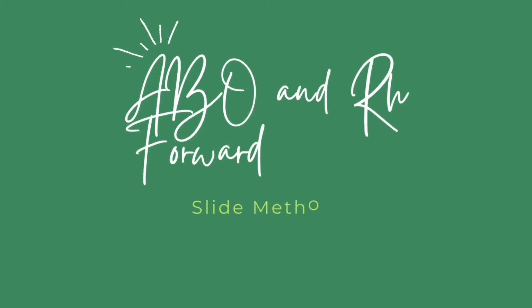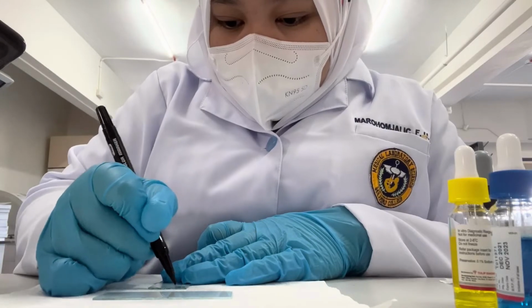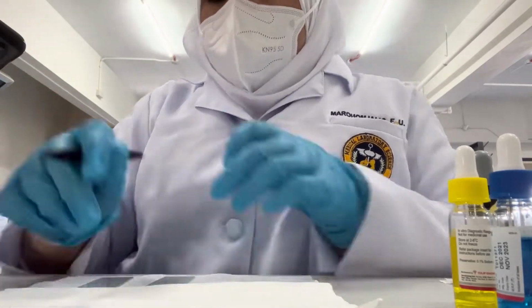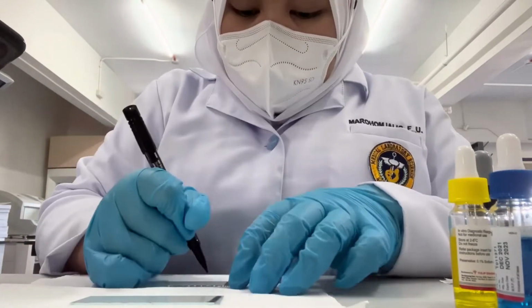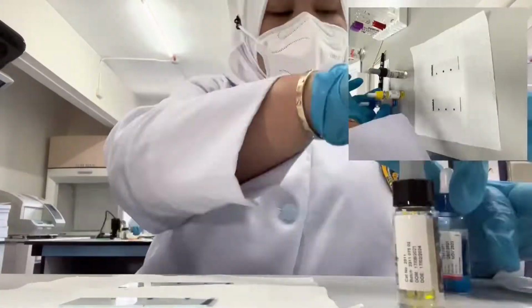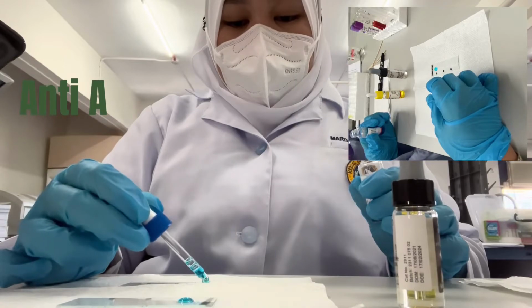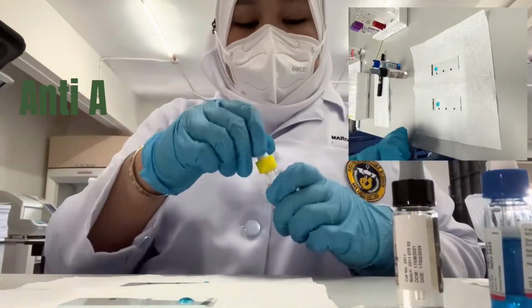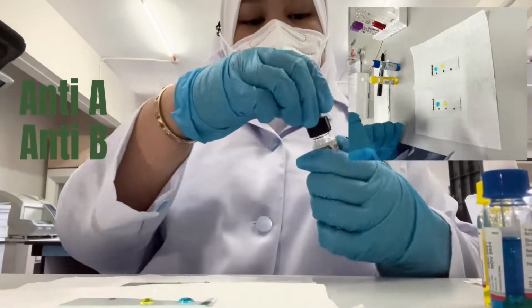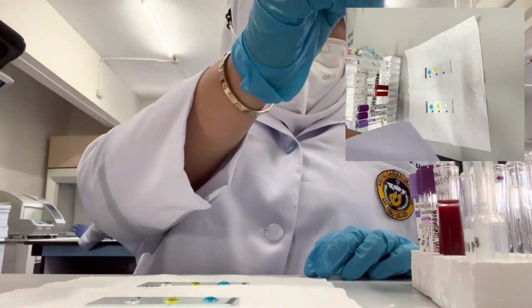Third is ABO and RH forward typing group using slide method. Step 1 is to label the slides with the patient's name. Step 2, add 1 drop of anti-A, 1 drop of anti-B, and 1 drop of anti-D on a clean labeled slide.